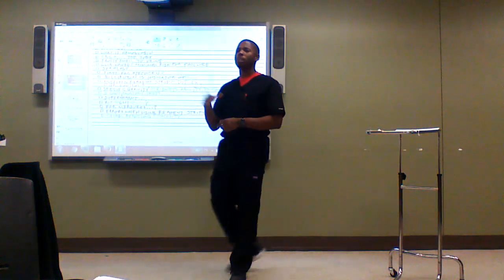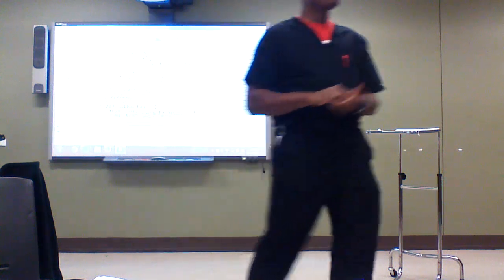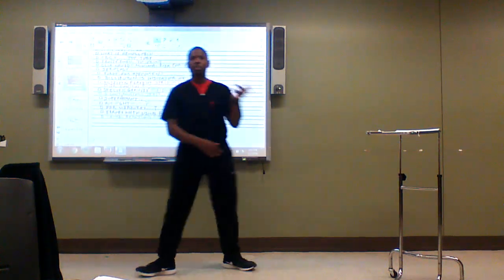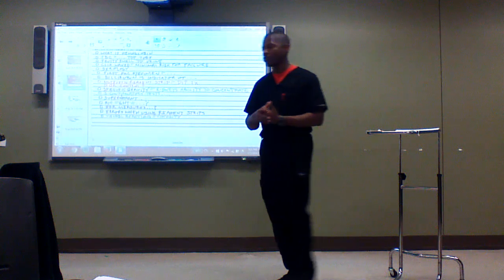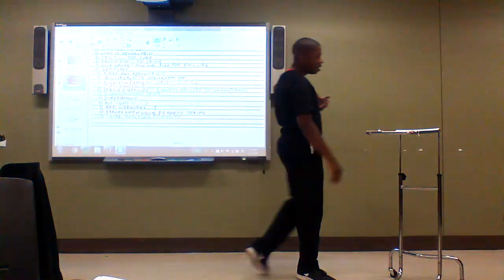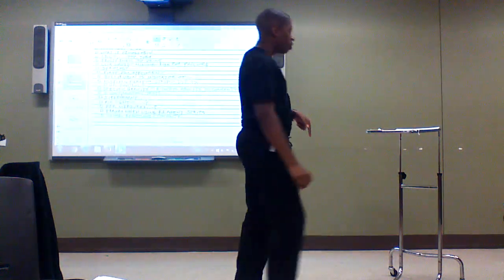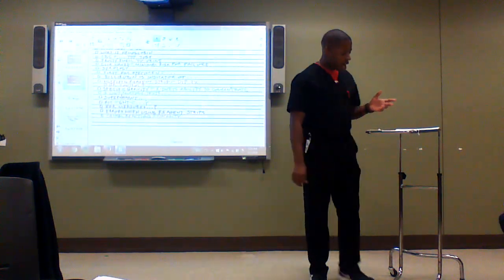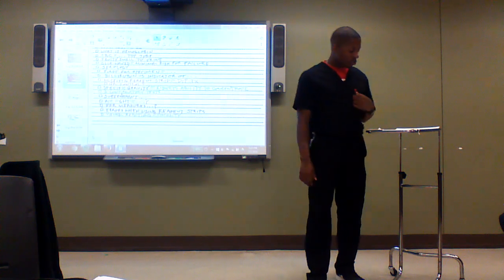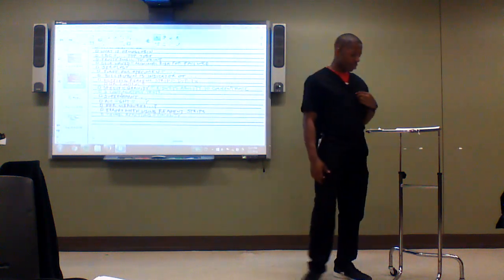First off, somebody tell me what quality control is. It makes sure that the laboratory tests are accurate. Right. Make sure that the laboratory tests are accurate. Okay? So when we're doing quality control of the multi-stick reagent strips, that's actually what it's called, multi-stick reagent strips. When we're doing that, we particularly are doing this as a test to make sure it's okay. So we may say for quality control measures for the multi-stick reagent strips that we would check, or would you say that you should check the expiration date on the bottle? Yes. Yeah, that's a pretty good idea.